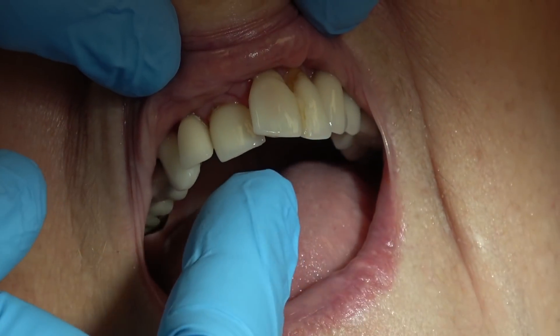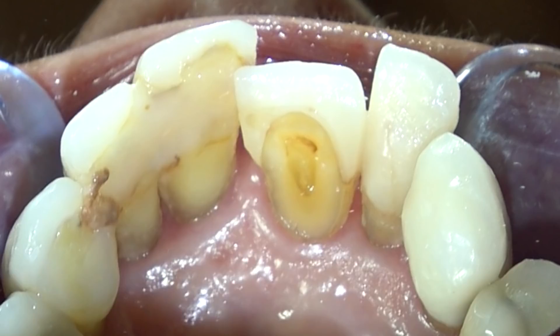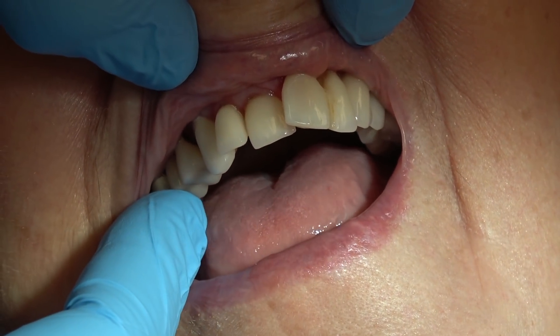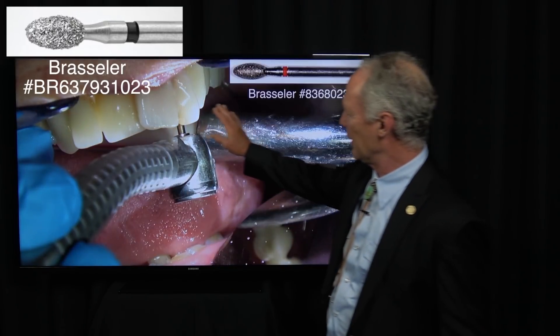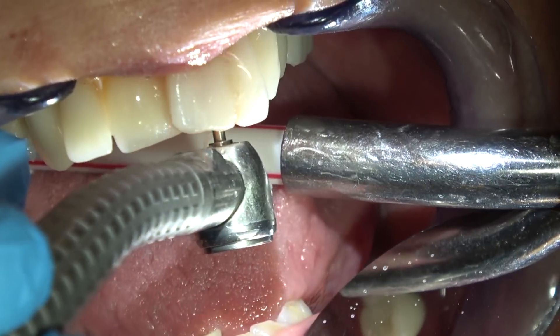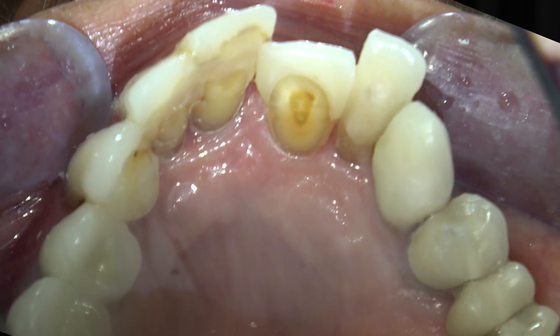You can see these teeth are very mobile. Not much bone around the teeth. I've already splinted these teeth together. We're not doing anything to the bridge on the other side. The first thing I'm doing is roughening the palatal side of the teeth to be splinted with the Ribbond and composite, using a coarse football diamond burr.